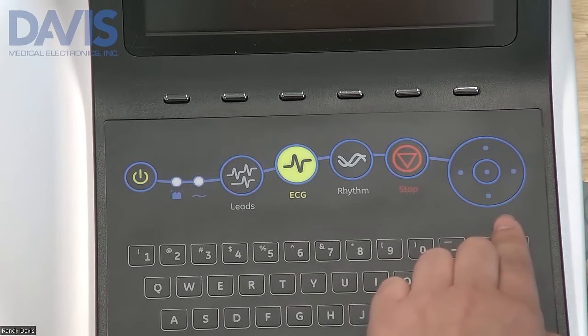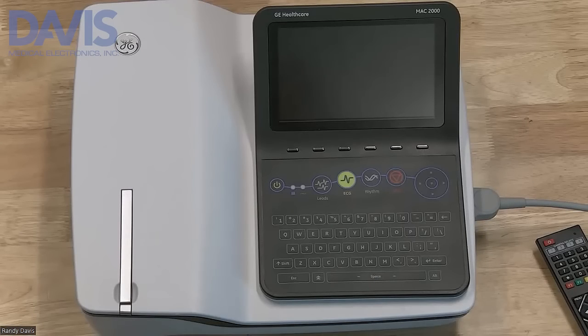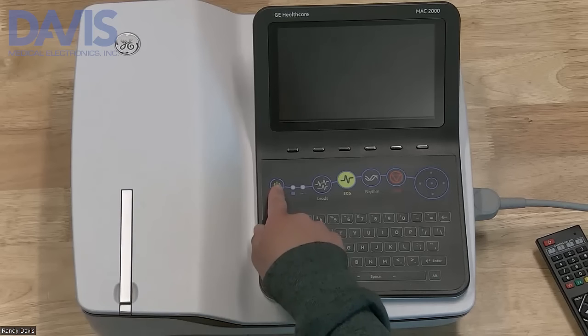You also have a directional trim pad key. To turn on the device, press and hold the power button.